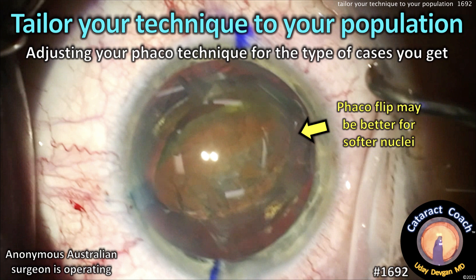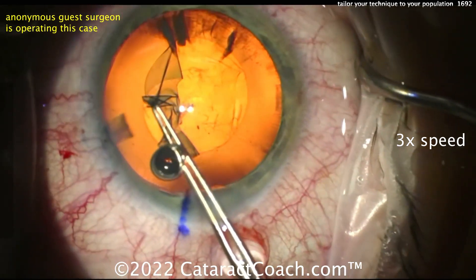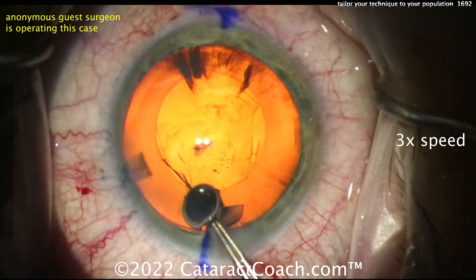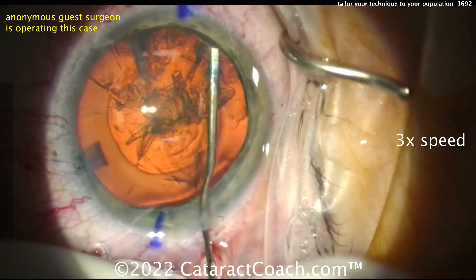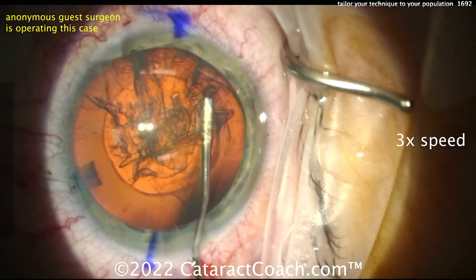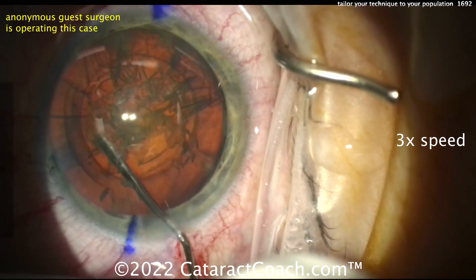You can adjust your FACO technique to the type of cases you get the most. We've got an anonymous guest surgeon here from Australia, and this surgeon mostly gets patients who have 2-plus NS, maybe 2 to 3-plus NS — patients who don't tend to have very dense cataracts. This surgeon has tailored his or her technique towards this exact patient population.